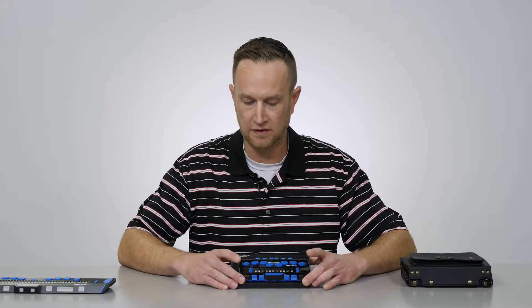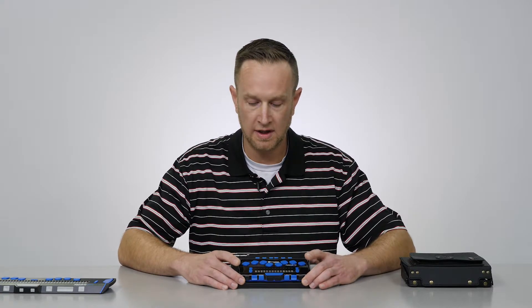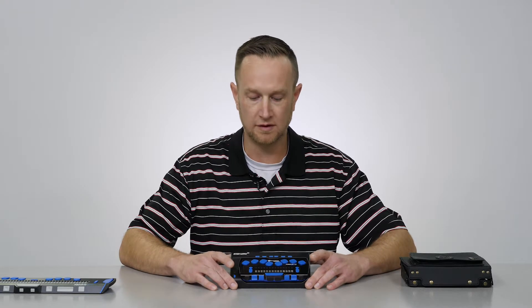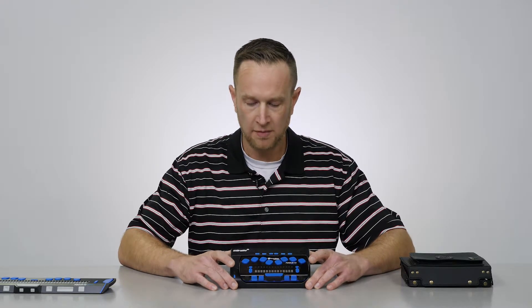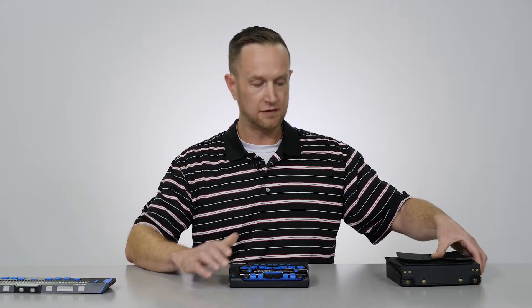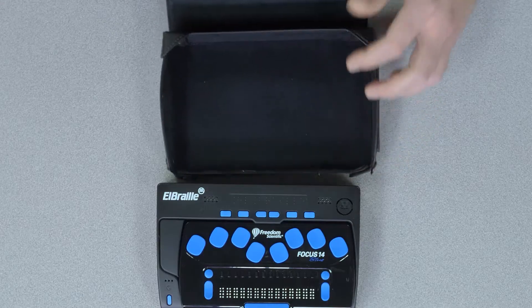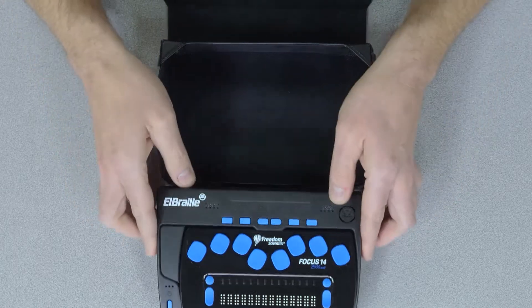All in all the LBraille itself is pretty reasonably priced, and together there are different combo prices that we can work out. But once you get that all together you have a nice portable note-taking device and Braille display. It also comes with a very handy carrying case, because if you're going to have a note taker like this you certainly want to have it in the carrying case at all times.